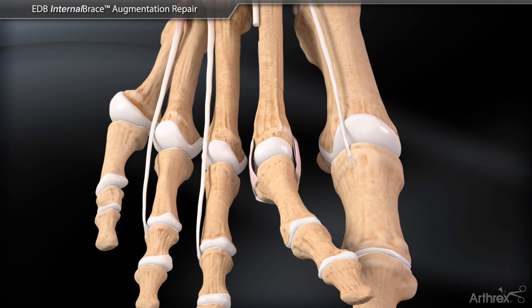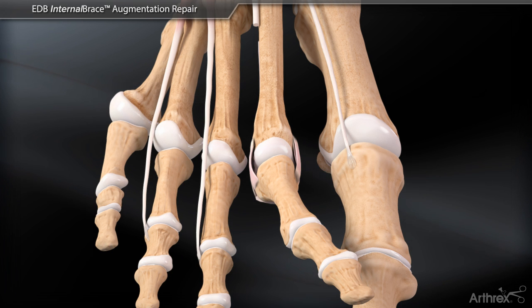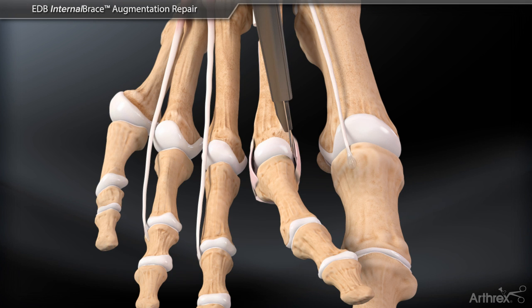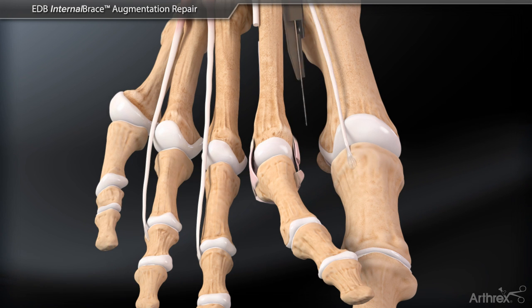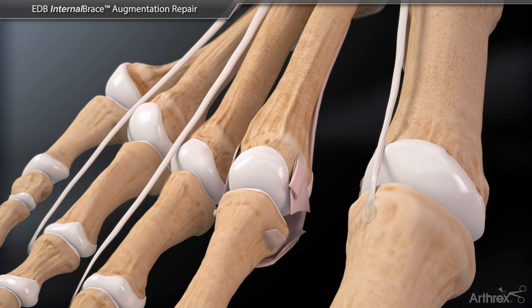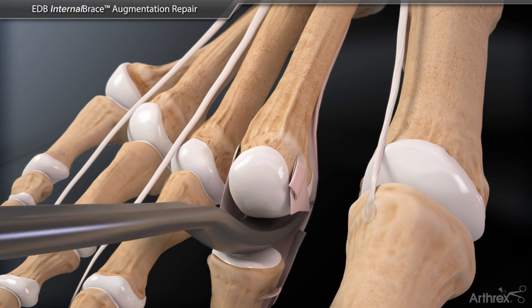This animation demonstrates a varus deformity correction. In this instance, the collateral ligaments are contracted medially and lax laterally causing the deformity. Next, a dorsal capsulotomy is performed and the MTP joint is exposed. Collateral ligament releases are performed to allow passive correction of the deformity. A McGlamrey retractor is used to free up the plantar plate proximally.